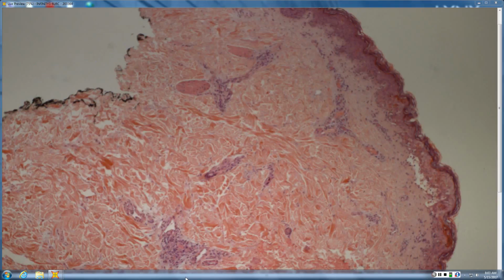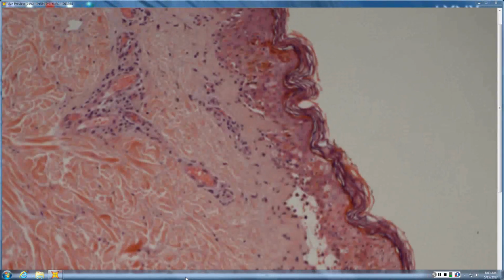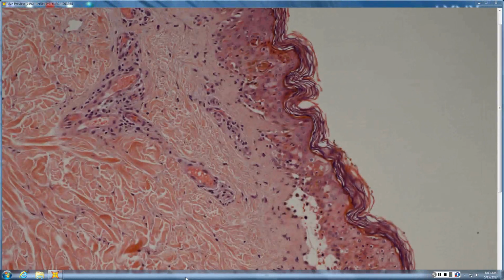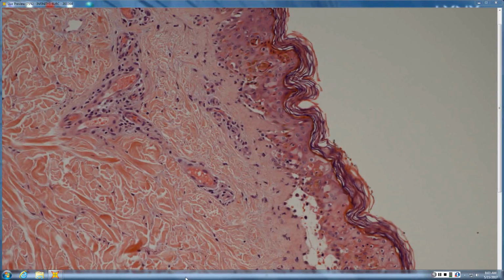By far, that's like 1,000 to 1. There are other drugs that can do it, but almost all of them are naproxen. So, maybe some death in the epidermis. Individual cell necrosis, satellite necrosis, some lymphs. Is there a lymphocyte at every site of necrosis, or is there death out of proportion to lymphs? I'd say probably death out of proportion.